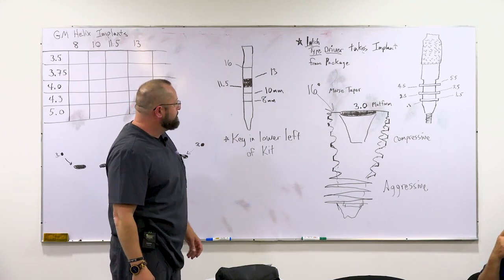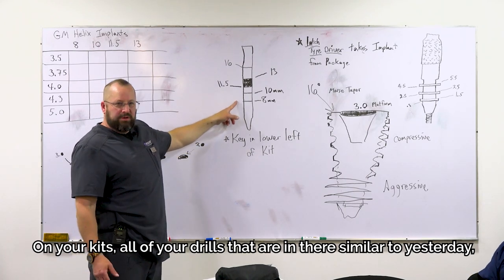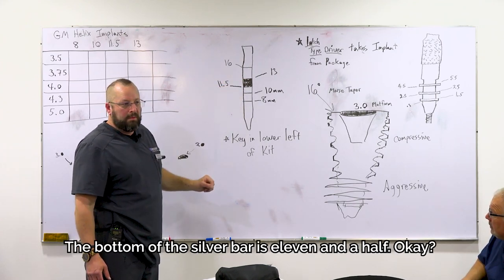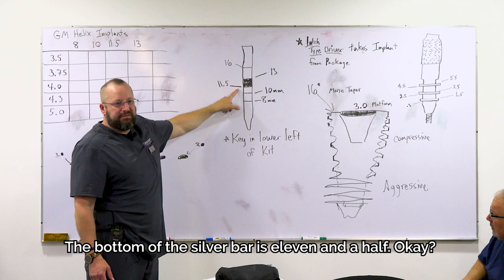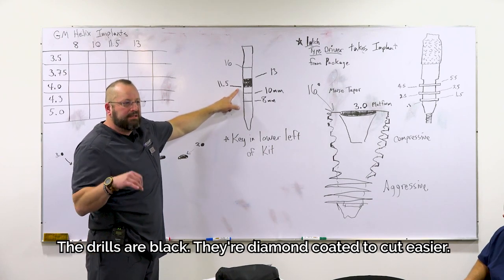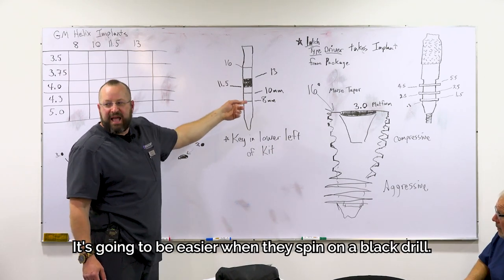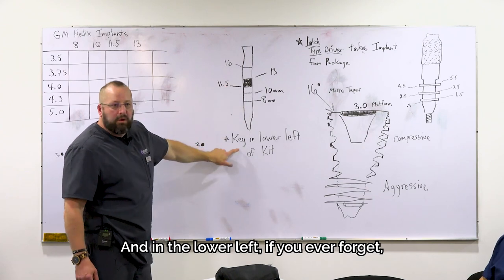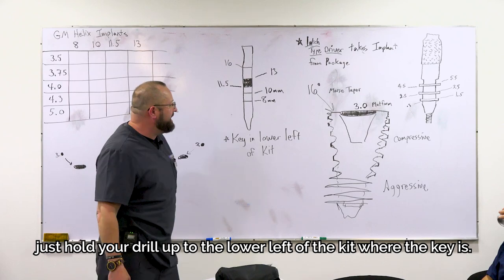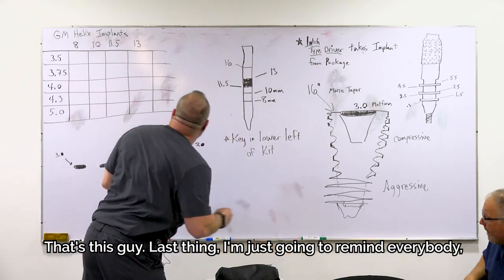Okay? On your kits, all of your drills that are in there, similar to yesterday, they're an 8, 10. The silver bar is what I call home. The bottom of the silver bar is 11 and a half. Okay? The drills are black. They're diamond coated to cut easier. Right? You're going to see the lines are going to be easier when they spin on a black drill. And in the lower left, if you ever forget, just hold your drill up to the lower left of the kit where the key is. Okay? That's this guy.